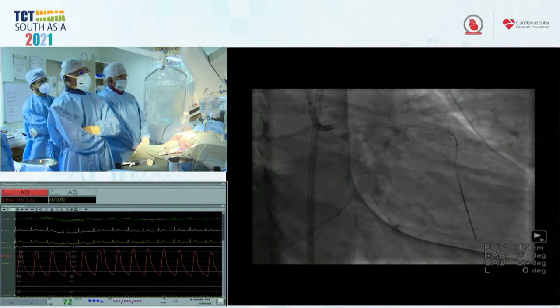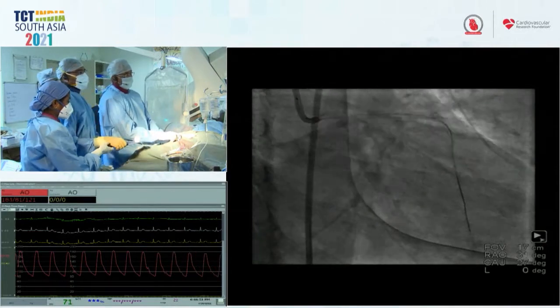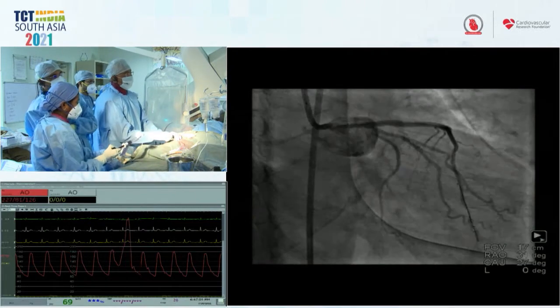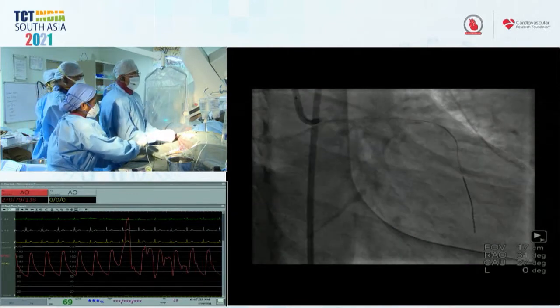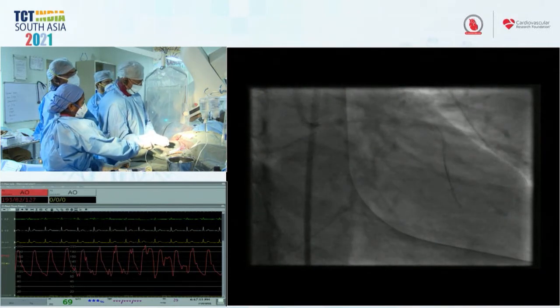So at this point it looks better. It may be imperfect, but I think to Ziad's point earlier, in these types of stent failure cases, you really are up against the wall with limitations in terms of how much you can remediate it. So getting it right the first time is really the edict here. And when we inherit cases like this, there's a balance between overly aggressive and what's good enough. Based on what you've done on that angiogram, and hopefully the OCT will confirm, I would suggest you're probably done.